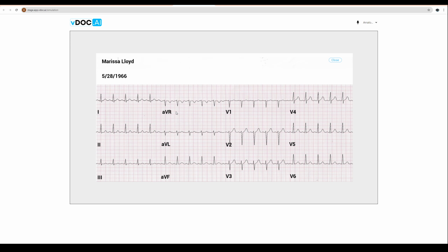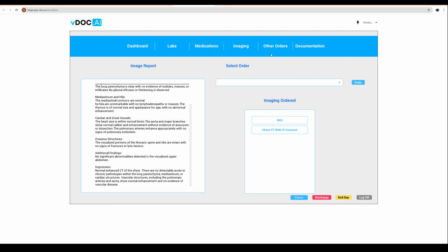And as we add more cases, especially more cardiac cases, there will be changes and improvements to this to give us ST changes, give us different rhythms. But if you have a patient and their heart rate's 160, it will reflect 160 on here. If it's 42, it will reflect 42 on here. And so this is, again, not a photo. This is created, and so if the heart rate changes and you get a new EKG, it will not be the same, and so it will never be the same twice. It could be similar because the heart rates and the rhythms and the ST changes are similar, but no EKG will be exactly the same, and so we're really proud of that.